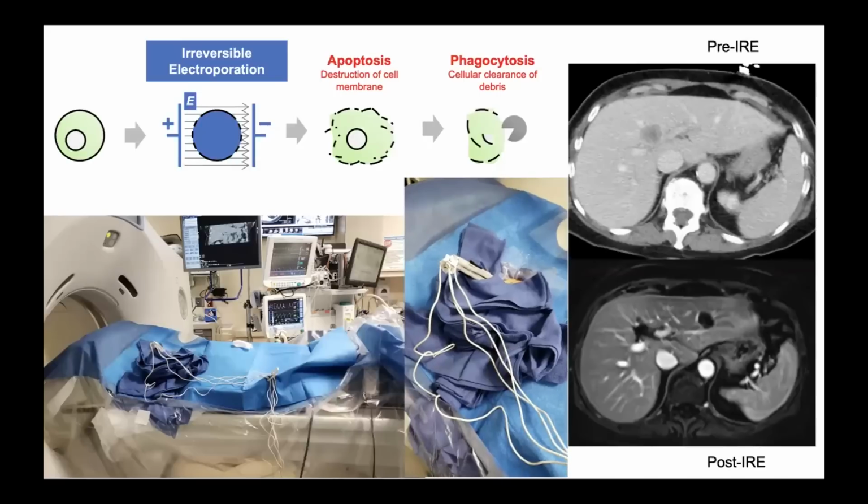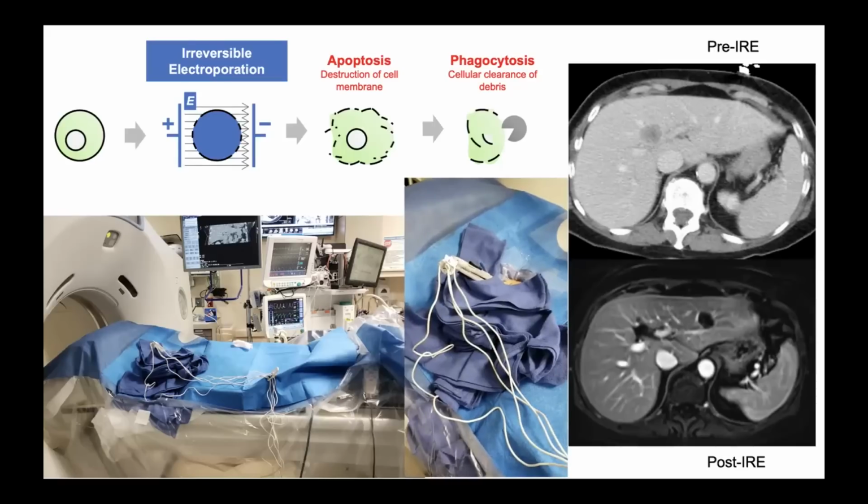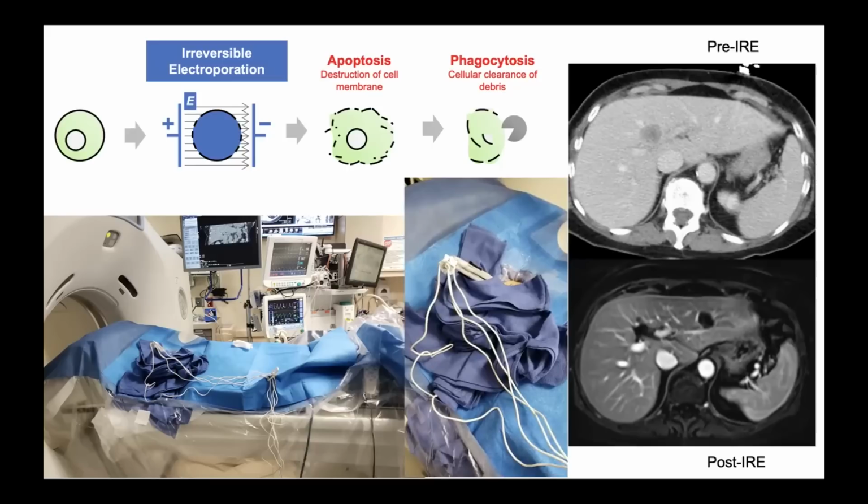Now, this is irreversible electroporation. You can see a similar concept of delivering energy to the tumor, as you can see on the right, but particularly in tumors that are in close vicinity to, let's say, the bile duct, portal vein, or hepatic vein, where it can cause either damage to the bile duct or a heat sink. We use this device where the energy, electricity basically, shocks the cells. So it's not really a thermal energy, but it shocks the cell, and it causes significant apoptosis, causing the cell membrane to break down and basically cell death.